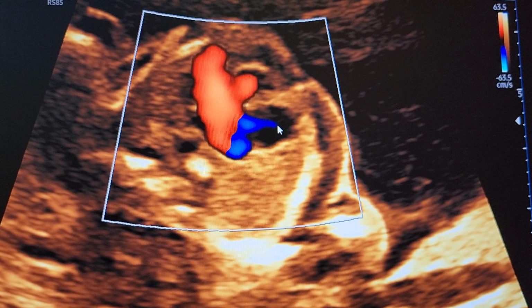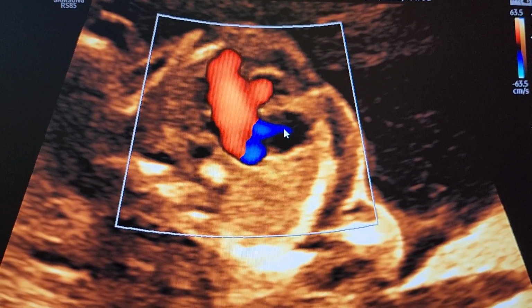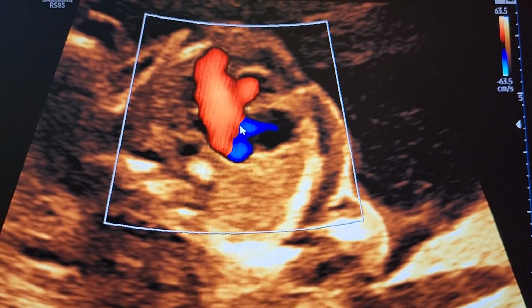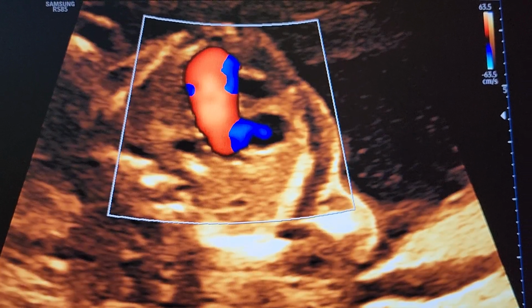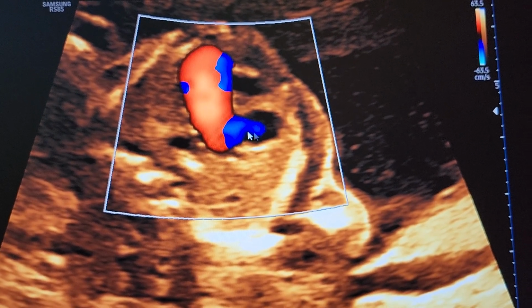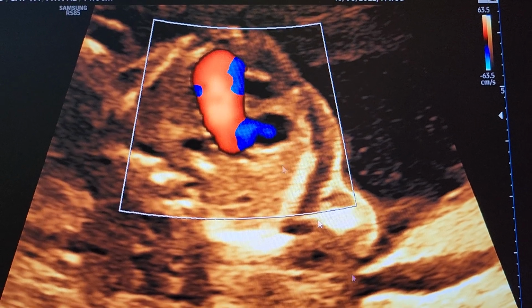This is the flow across the fossa ovalis. So you can see the fossa ovalis blood is from right atrium to left atrium, whereas the VSD flow is from left ventricle to right ventricle. So that's how the right ventricular lumen is kept patent. So this is again a 4-chamber view showing only flow from LA to LV.